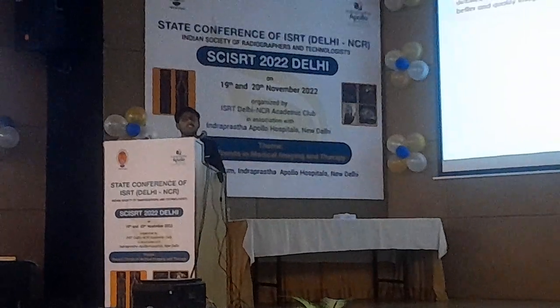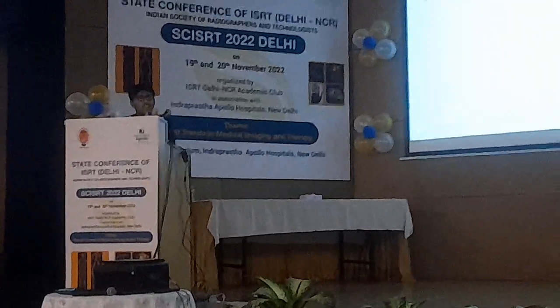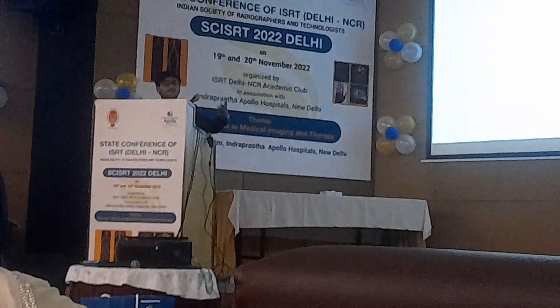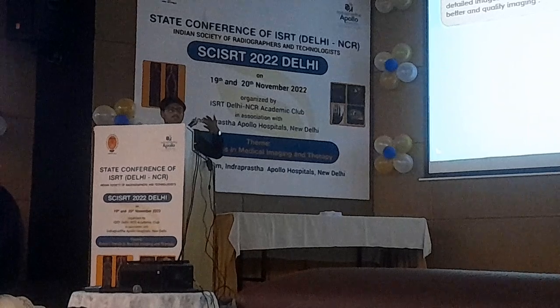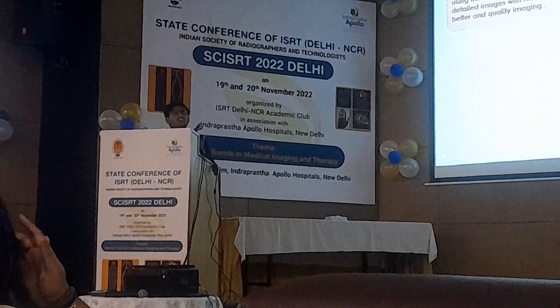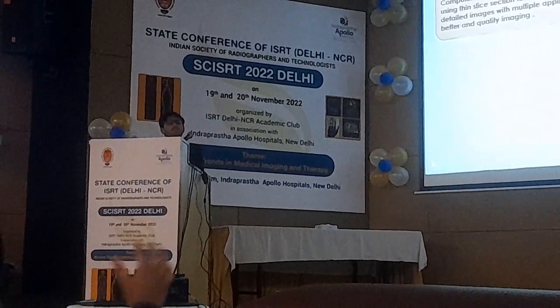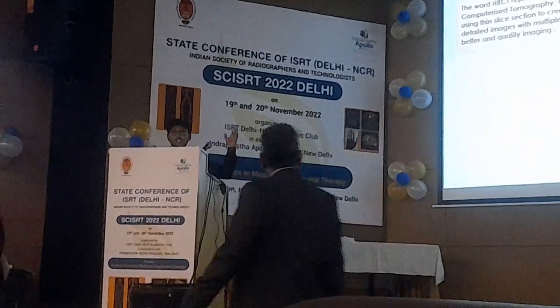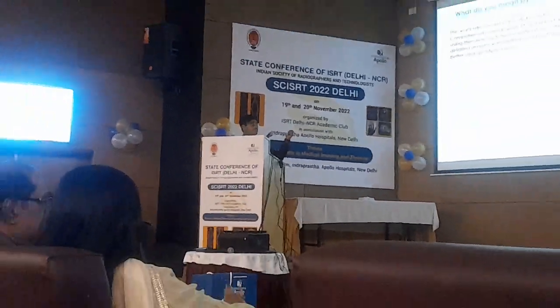When we go for a CT image, we think these are sequential images, and we do a recon on that and get a sequence image at 0.625, or we can go to 0.5, lower than 0.625. But this is actually a separated image of the raw data, and we can't get the actual raw data which is acquired by the accumulated value at a scale level of 0.625.